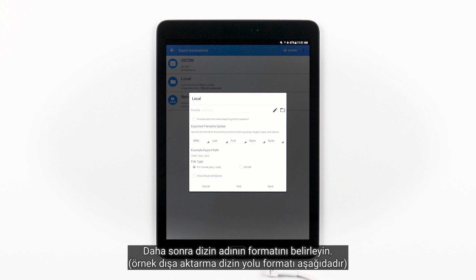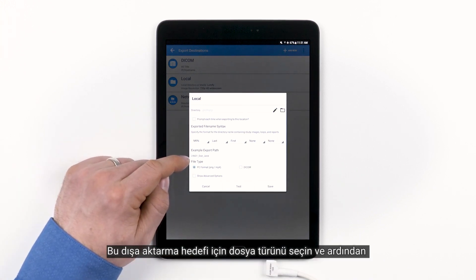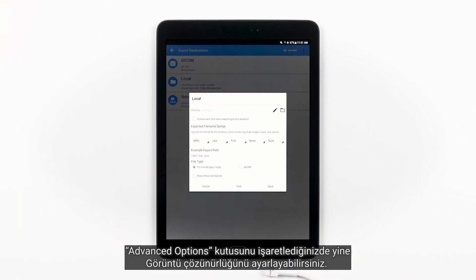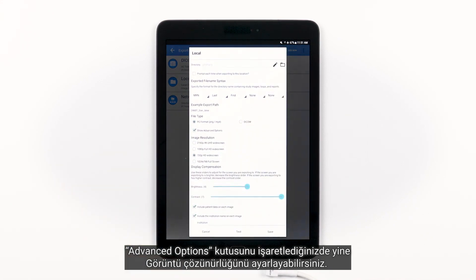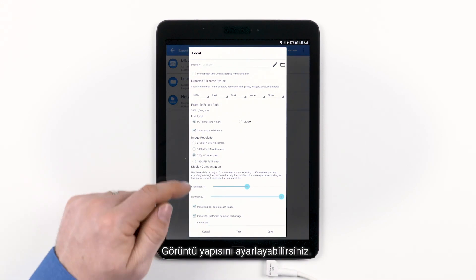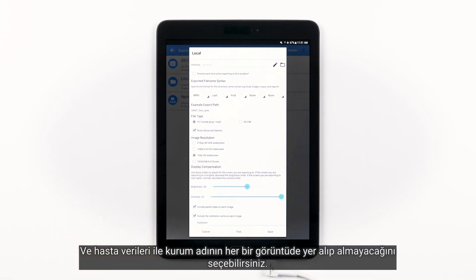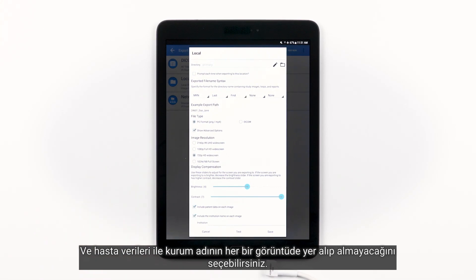Next, specify the format for the directory name — you'll see an example export path below. Choose the file type for this export destination. By checking the Advanced Options box, you have the option to adjust the image resolution, adjust the display composition, and choose whether or not you want to include patient data and institution name on each image.